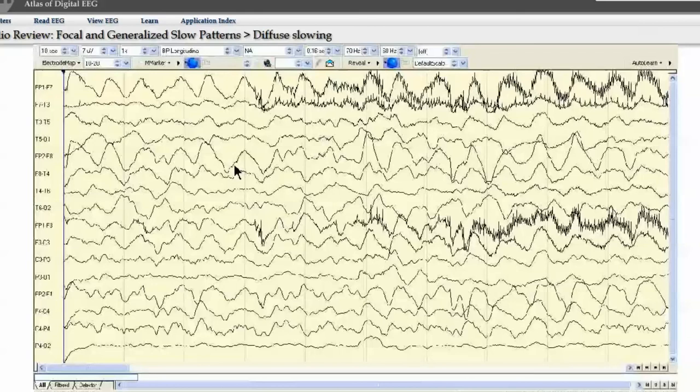However, the answer becomes much clearer here at the beginning of the 4th second. We see incidentally anteriorly on the left the muscle artifact that occupies the first 2 channels. This occurs as the frontalis muscle contracts and muscle action potentials are produced. At the same time, we now see a resolution or regression of this sleep spindle activity, as it is no longer present in the same derivations further along here.